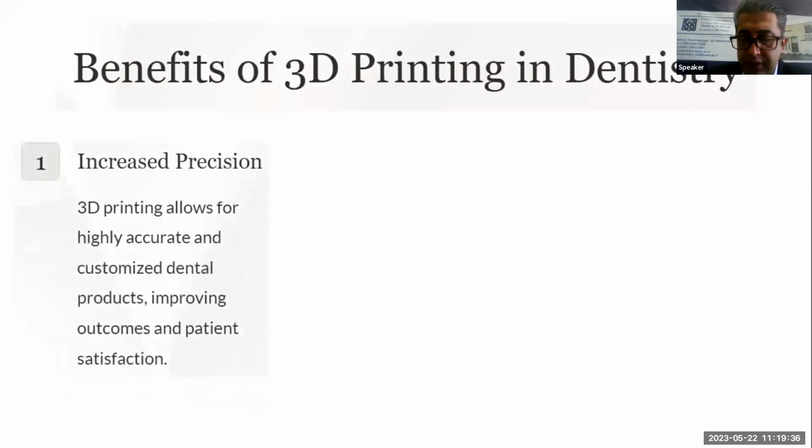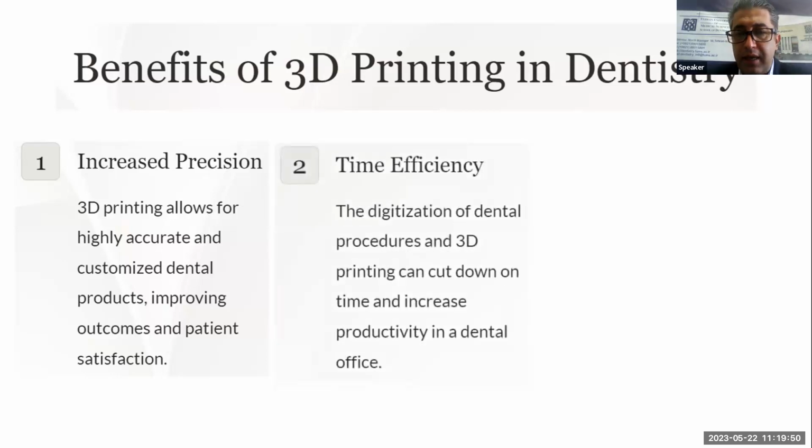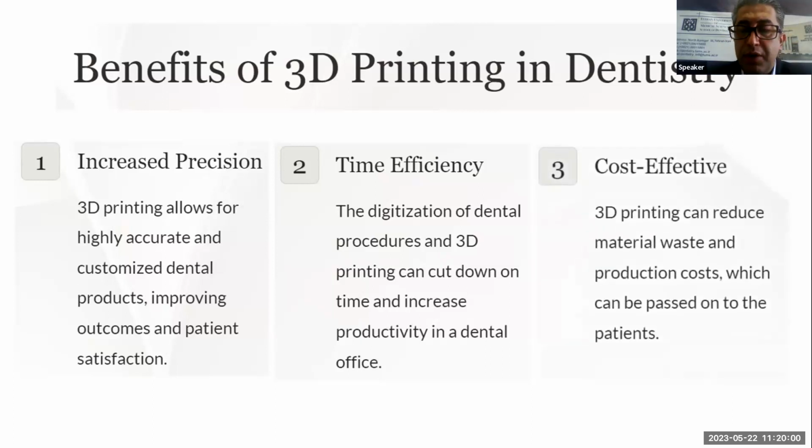Okay, 3D printing has a lot of benefits, but I want to mention two of them. The first is that it can increase the precision of our treatment, so the outcome is a rise in patient satisfaction. The second is that we can reduce the time of the treatment, because most of the planning is done before the patient comes to the office. That's why we can reduce the time of treatment.